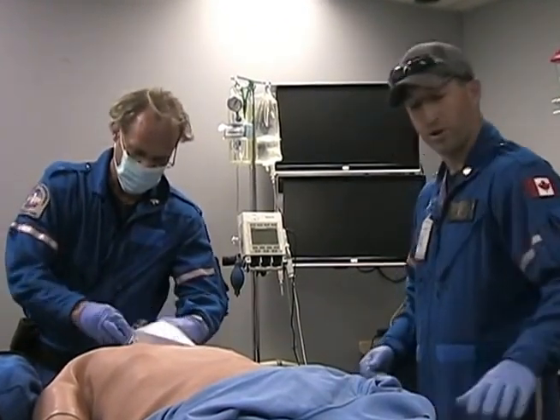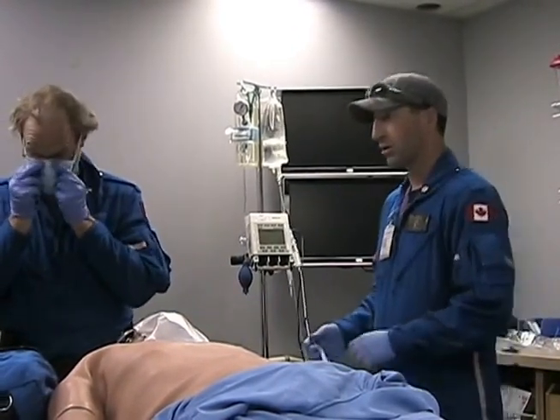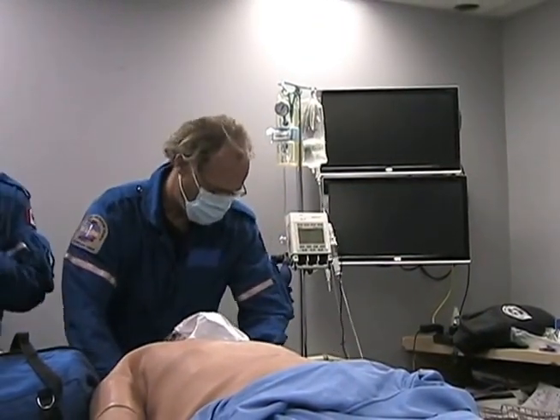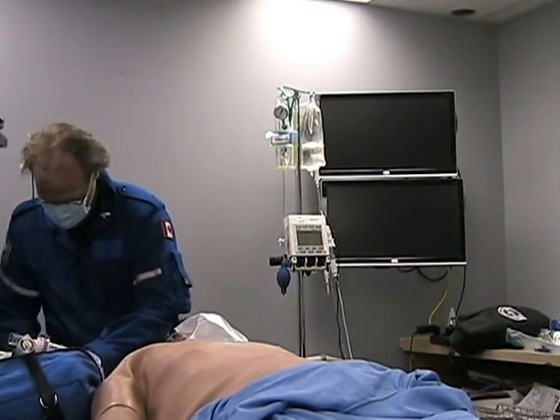What can I do there, partner? My drugs are ready to go. Okay, if you want to get the monitor and the end tidal and get the bagger ready, that would be great. You betcha. With those NPAs and OPAs in, you don't hear any more snoring? No more snoring. Okay, and the sats are still 99? Sats are 99. Perfect, thank you.